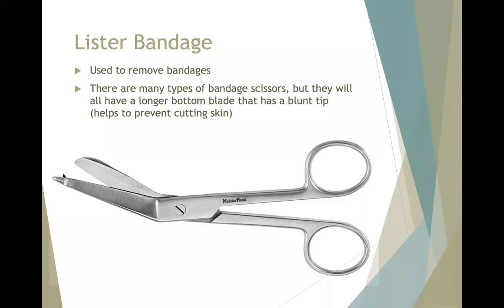If there was no blunt tip here, as you're taking this lower portion of the jaw and moving it up the bandage, it could definitely pinch in the skin. The skin could collect up and you could accidentally cut the skin of your patient while you're trying to remove the bandage. So really important that we only use bandage removal scissors when removing bandages. We don't just want to take any scissors and do it. Again, because they have this blunt tip here. Now, these are the only scissors that you're going to see with this blunt tip. So right off the bat, taking a look at these scissors, I identify that it has that chunky blunt tip at the end. Those are my bandage scissors.